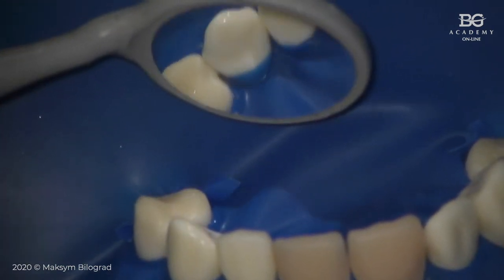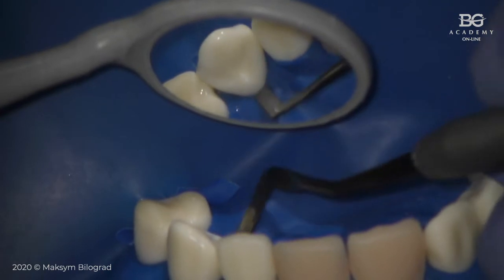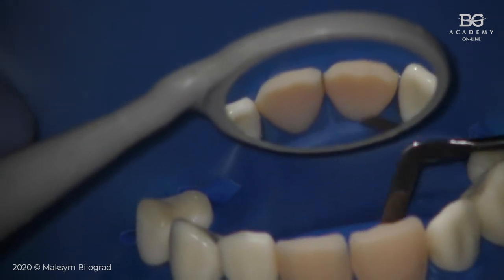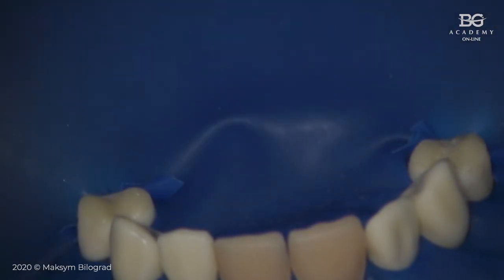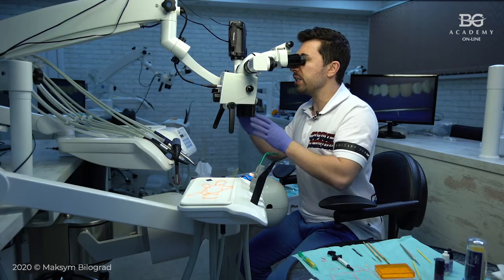So for the palatal side, for example, you can use your plastic instrument, as you can see here. You just invert your rubber dam with the plastic instrument here. It will be easier now because you have already provided some steps of inversion with floss utilization. Okay, good. In our case, we have supragingival preps, so isolation is pretty easy.